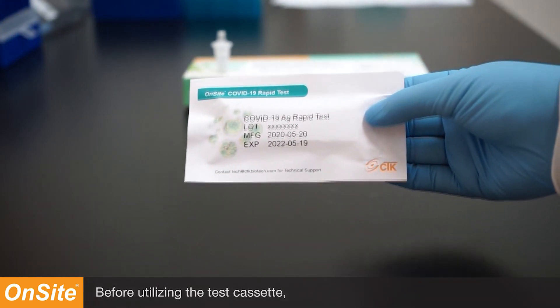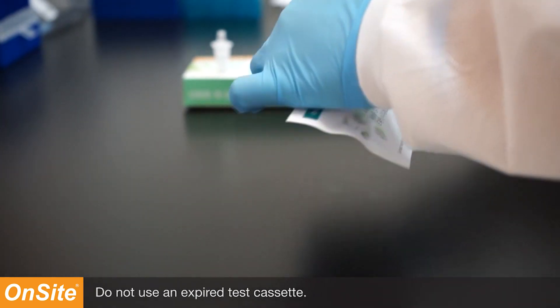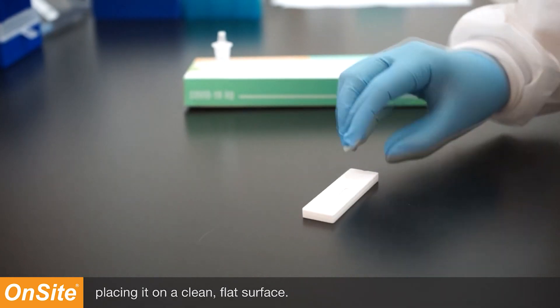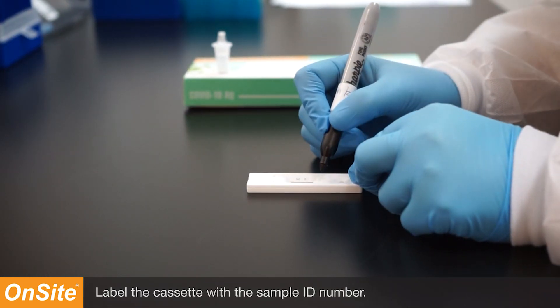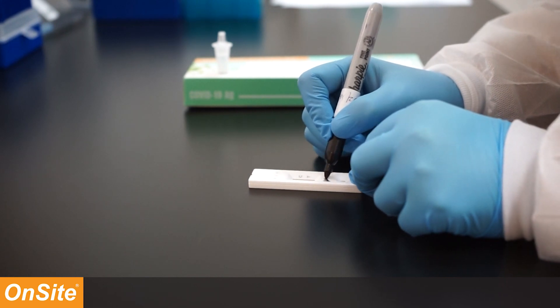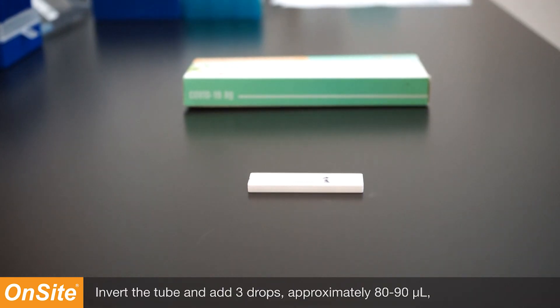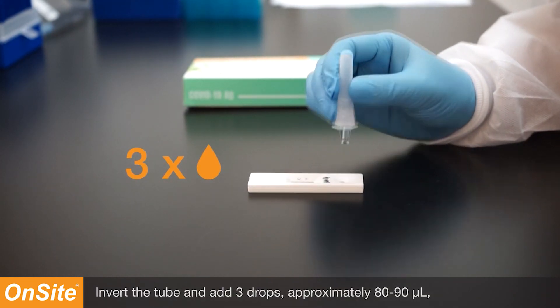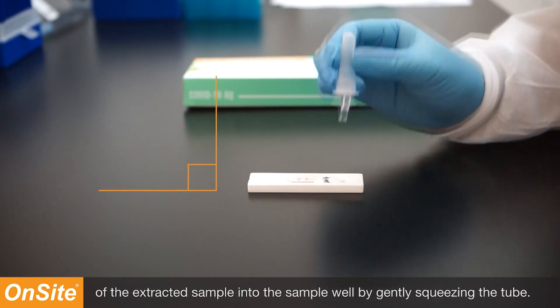Before utilizing the test cassette, make sure to check the expiration date. Do not use an expired test cassette. Open the pouch and remove the test cassette, placing it on a clean, flat surface. Label the cassette with the sample ID number. Invert the tube and add three drops, approximately 80 to 90 microliters, of the extracted sample into the sample well by gently squeezing the tube.